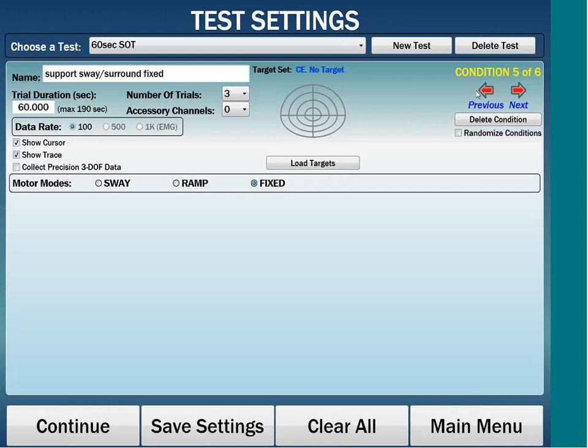In contrast, the CRS system does present performance feedback after every trial, where you could actually see your patient's COF, COG in both X and Y direction, as well as motor positions and whatnot. So I will say yes to save the data.